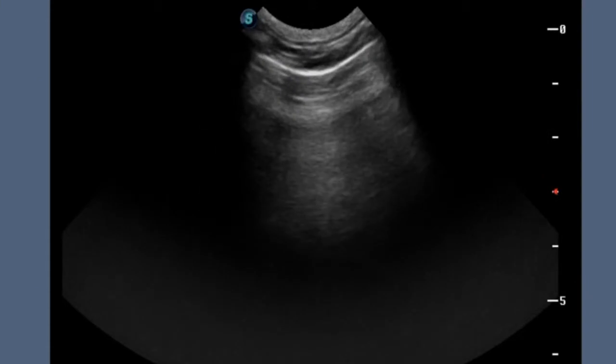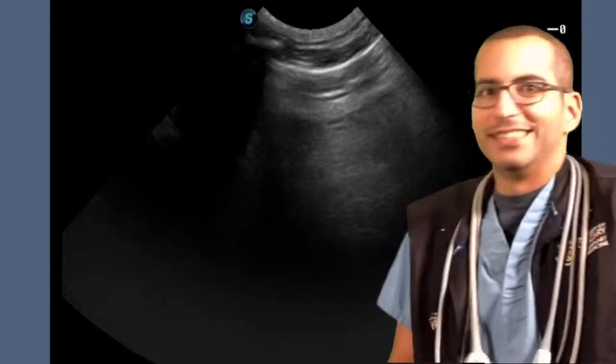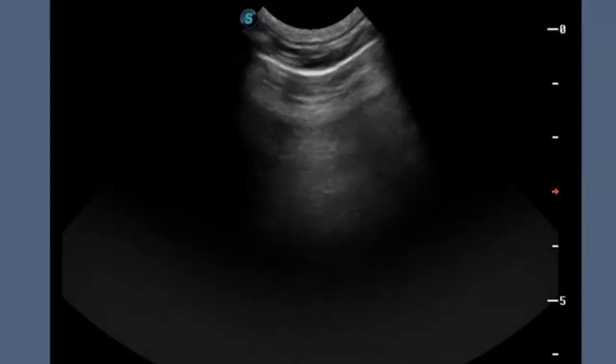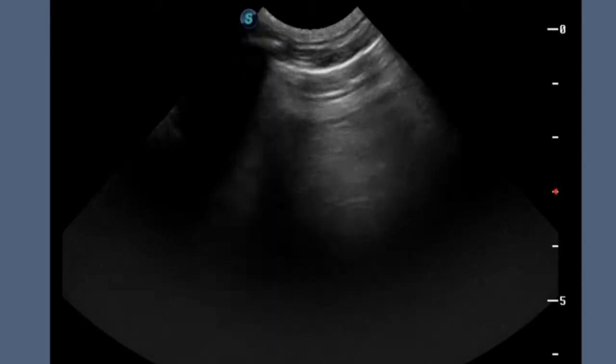Just to recap here, let's just do a test. What do you think, Serge? Do we have normal lung or abnormal lung? Whoa! What was that? I think that was a B line. Normal or abnormal? Normal. Okay, good. So do we have a glide? If we have a B line moving back and forth, we have to have a glide.